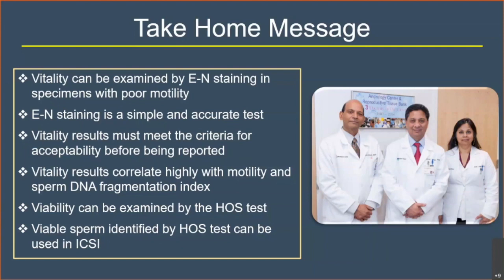And viability can be examined by the HOS test, and this test can be used for therapeutic purposes such as in ICSI. Next slide, please.